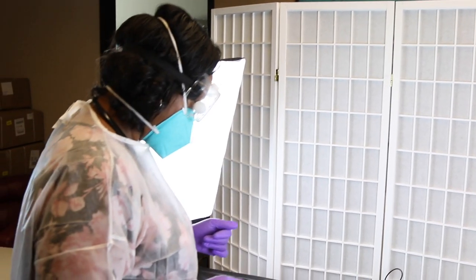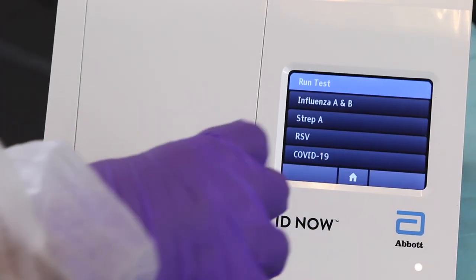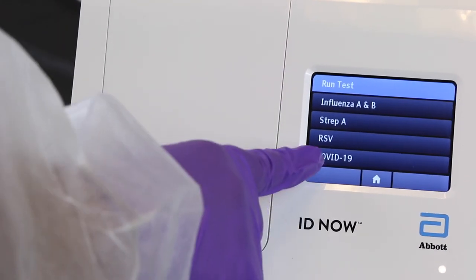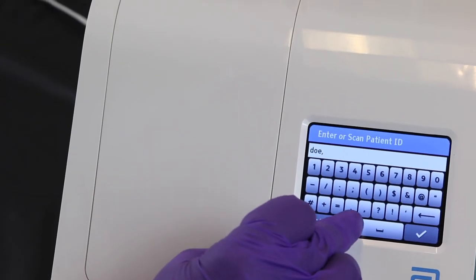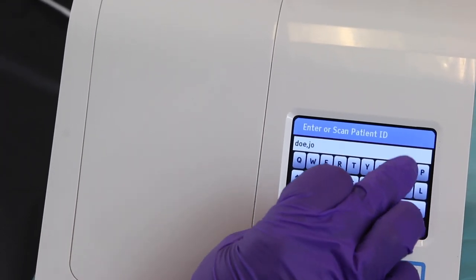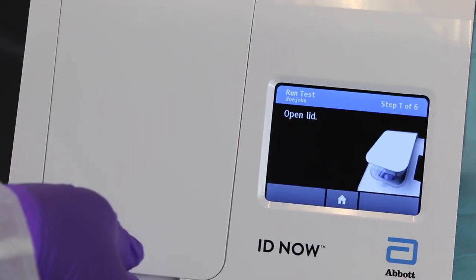After both QCs are completed and when it comes time to collect a specimen from an individual, you must put on full personal protective equipment. On the Abbott machine, hit 'New Test', then hit 'Run Test'. When it asks what kind of test you would like to run, select COVID-19. Enter the patient's name in this format: last name, comma, first name. Hit the check mark to confirm the patient information, then hit 'Run Test' and OK.